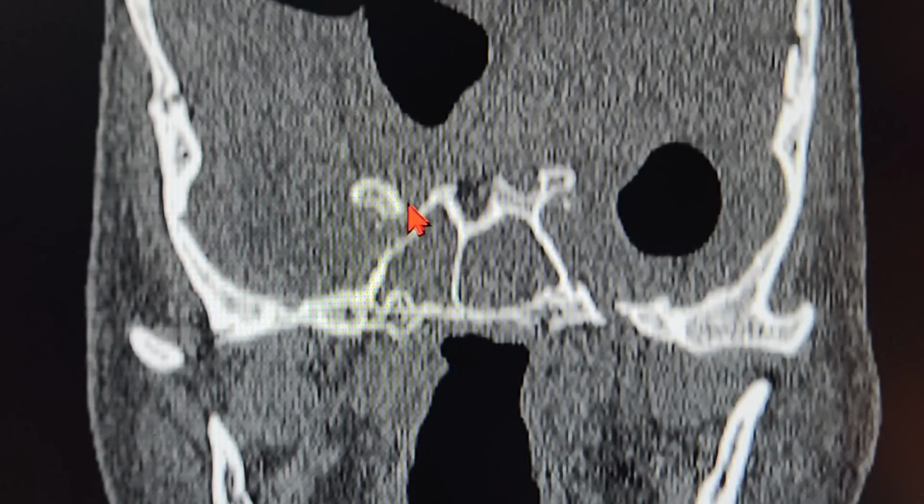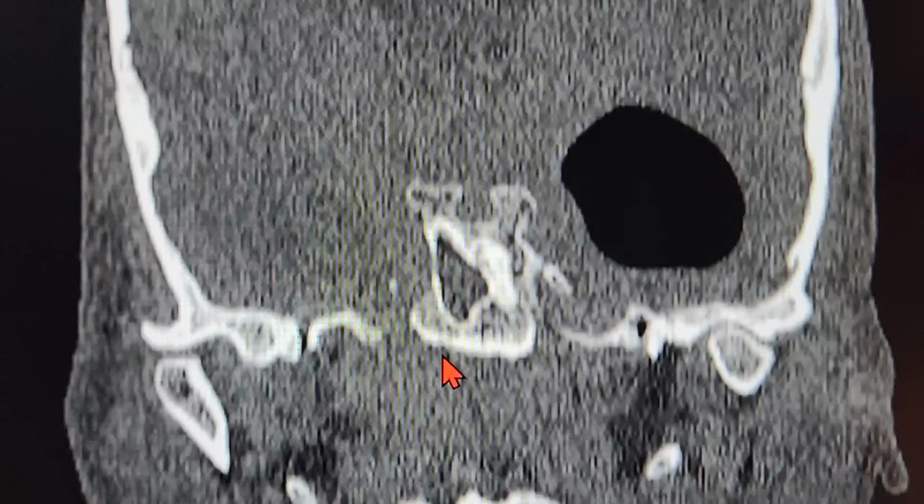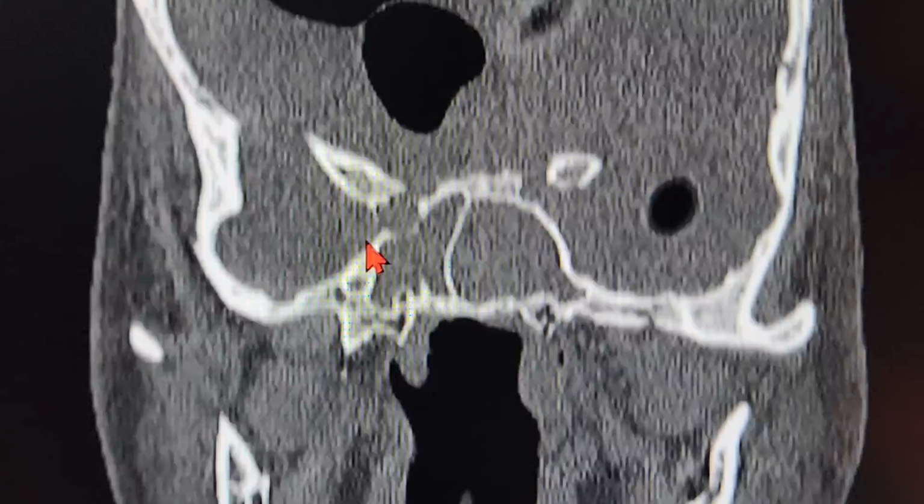Slight cortical bony damage I can see over here. Could be because of the demineralization from some metabolic issue. Does not look like a fracture to me over here. That's the ICA area. Okay, so it's worth checking out the sphenoid. Anyways, we're going to do a full house.